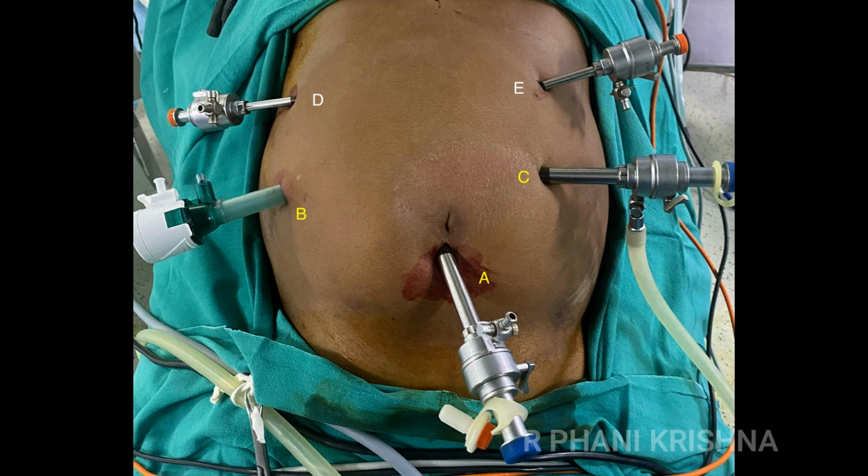So the ports are placed in this fashion. A, B, C are the 10 or 12 ports, and D and E are the 5 ports. So the surgeon has access to work from all sides. A can be the camera port, with B and C as the surgeon's right and left hand working ports, and D and E will be the assistant ports.